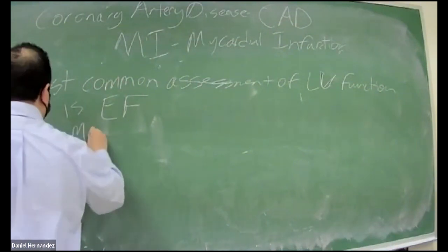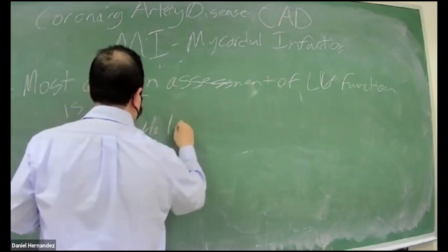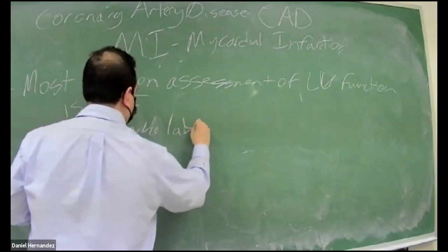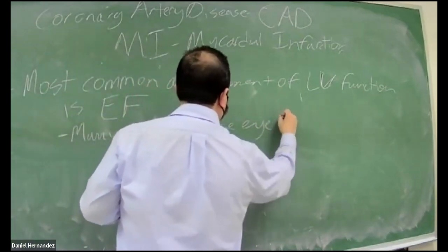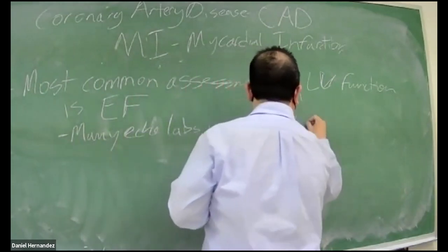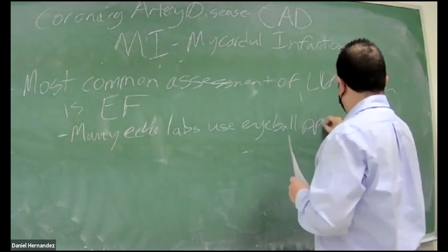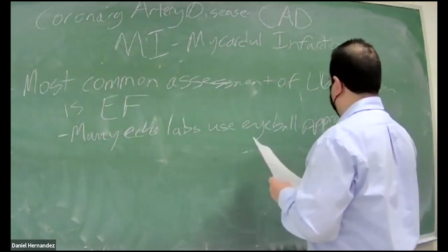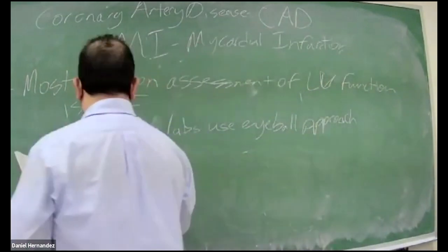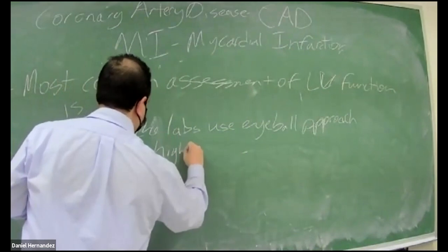So many echo labs will use an eyeball approach. This is highly user dependent.